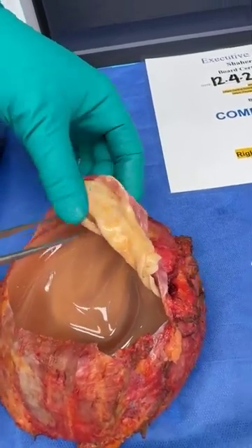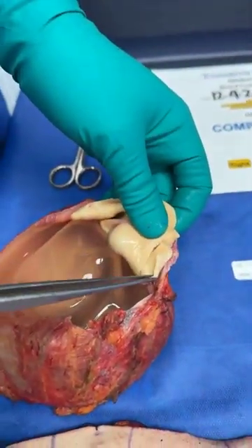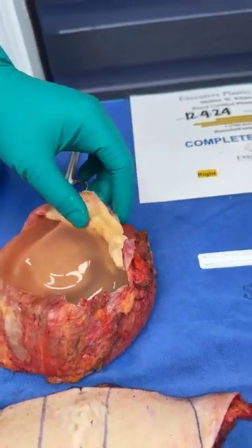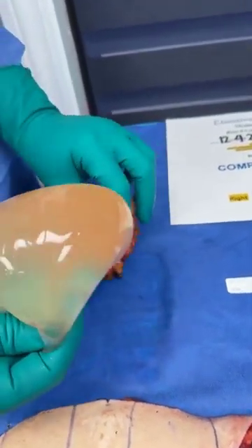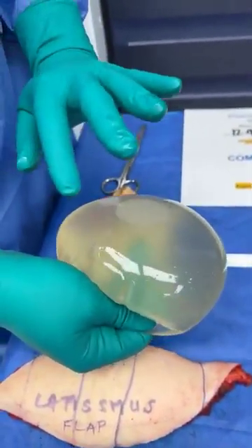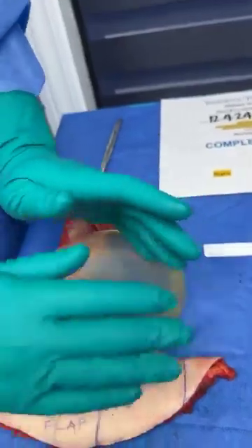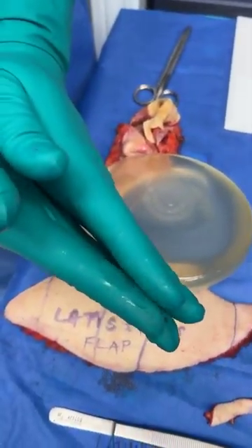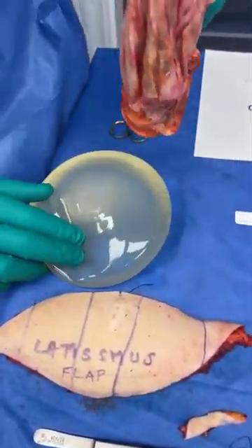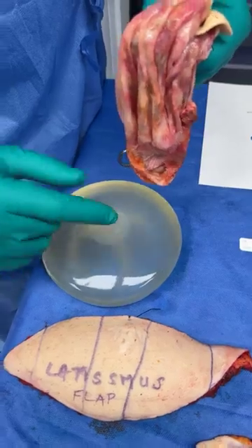And this is your alloderm, which is cadaveric skin. And you can see how it's folded up on itself. You see that? It was not anchored properly, and you can see how it's folded up on itself. And I'm going to go ahead and remove it. Look at this small amount of fluid. And you can see that fluid is all contained. And as I put it here, this is your 650, just like the operative note said, style 20.